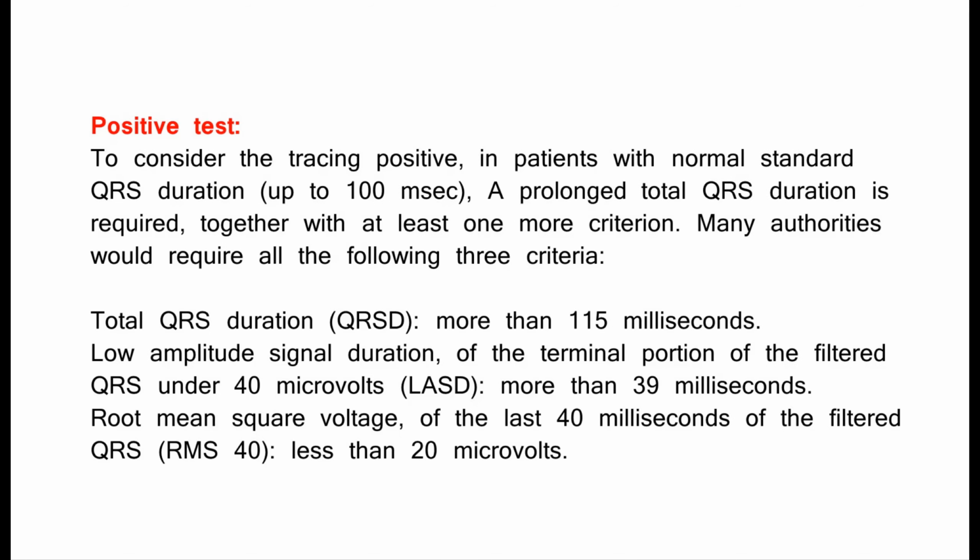Positive test. To consider the tracing positive, in patients with normal standard QRS duration, up to 100 milliseconds, a prolonged total QRS duration is required, together with at least one more criterion. Many authorities would require all the following three criteria.